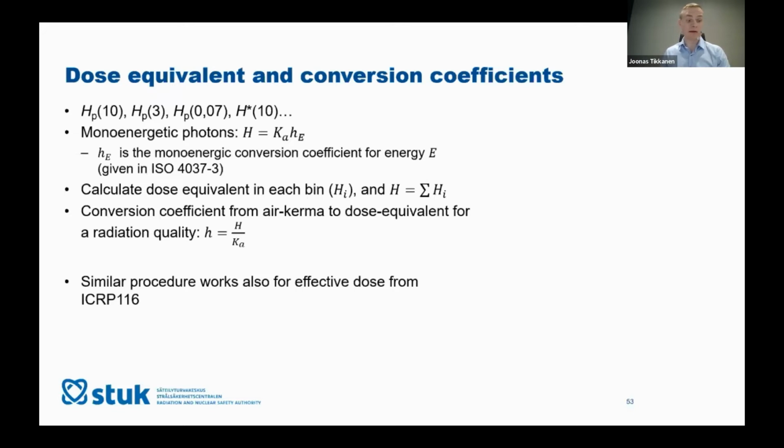And for all these other different things that you can do with the spectrum, the principle behind it is very similar. You do mathematics for each bin of the spectrum and then sum or calculate some average over the spectrum.